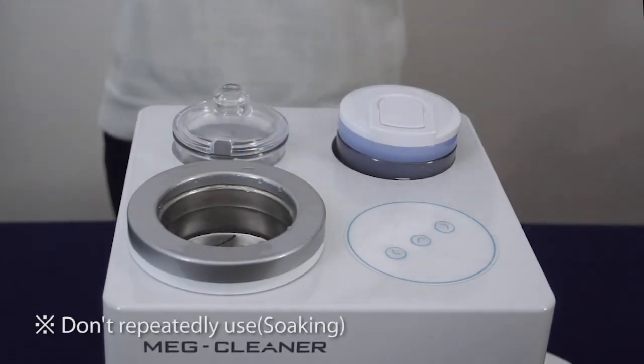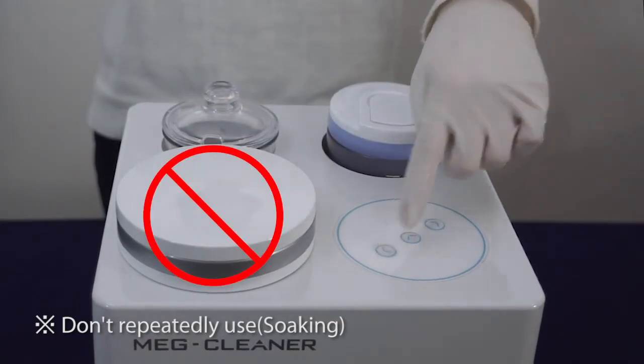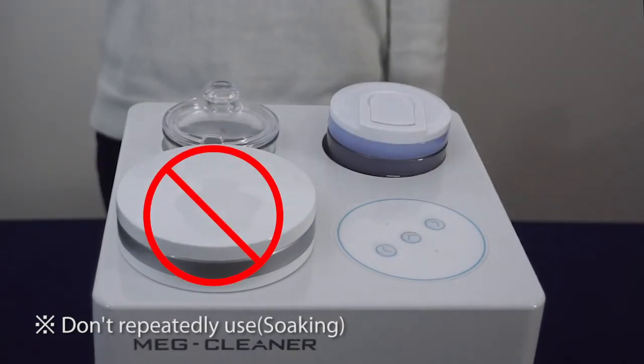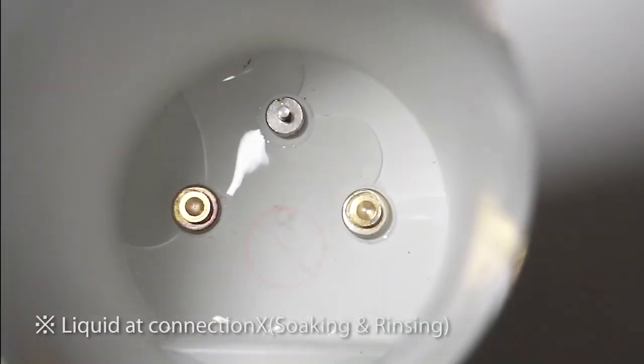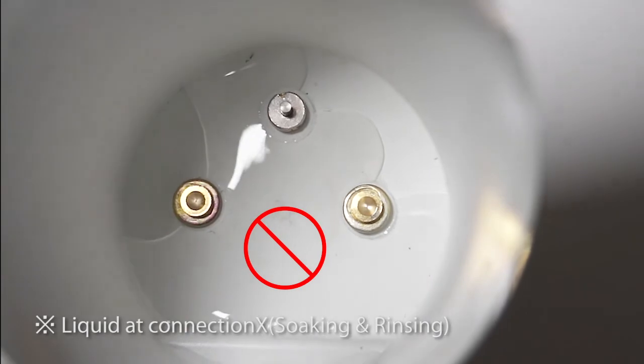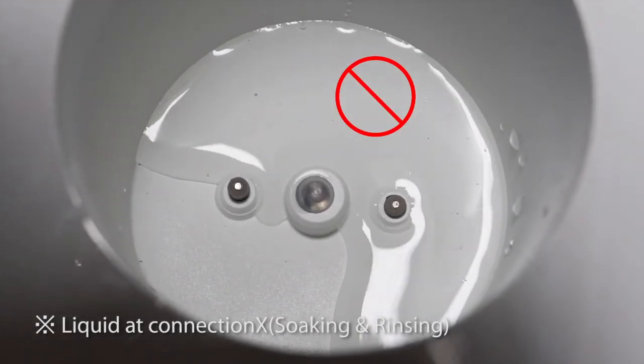The cleaner can be damaged if ultrasonic cleaning is done repeatedly. Please let it rest for at least 25 minutes before the next usage. Please turn off and remove moisture on the unit with a dry cloth, especially the contact point between the jar and main body.